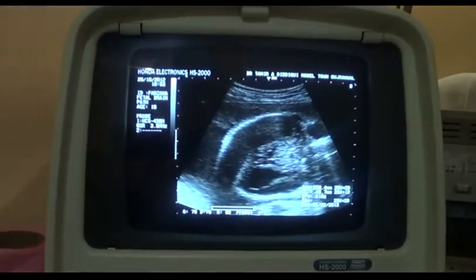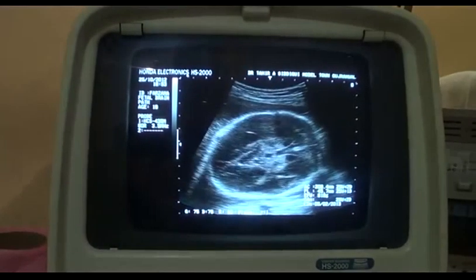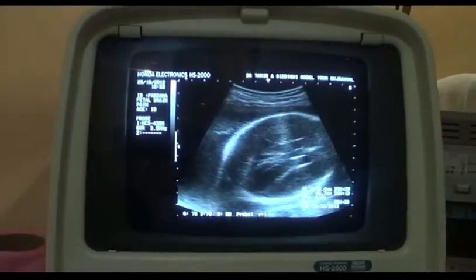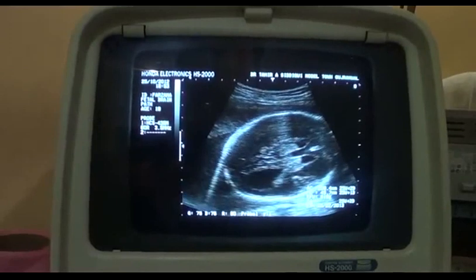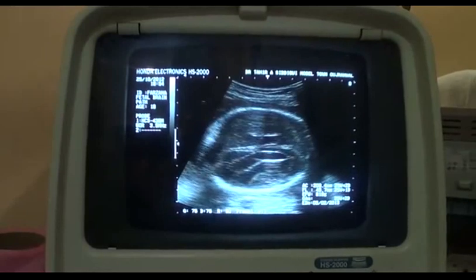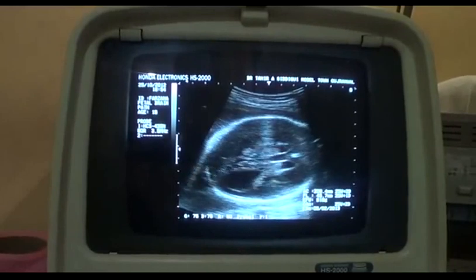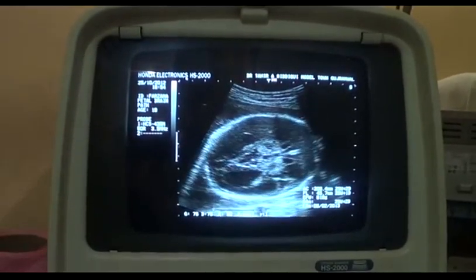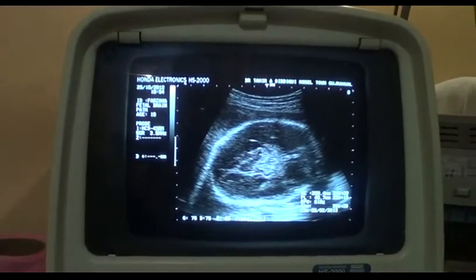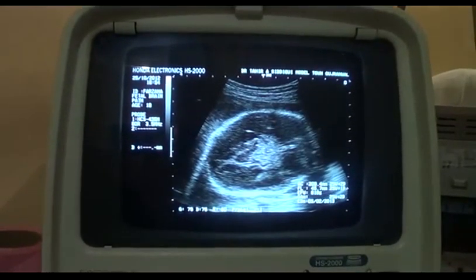Now this is the third ventricle. This is the area of the third ventricle, this one. And the third ventricle is not that clearly seen. Whereas here you see the dilated lateral ventricle, and we do not see the third ventricle. This is the area of the third ventricle, and it appears to be totally blocked by echogenic material.